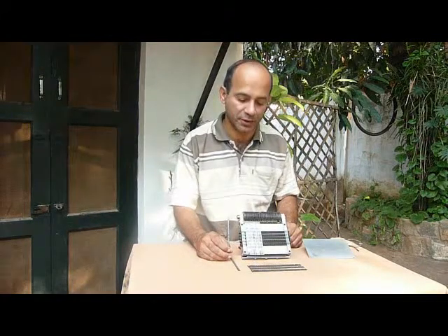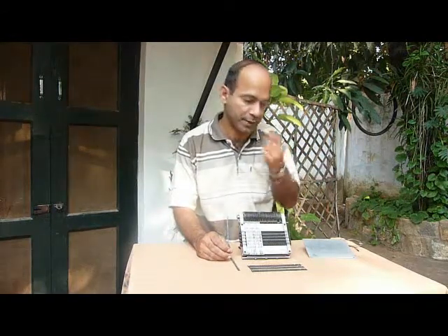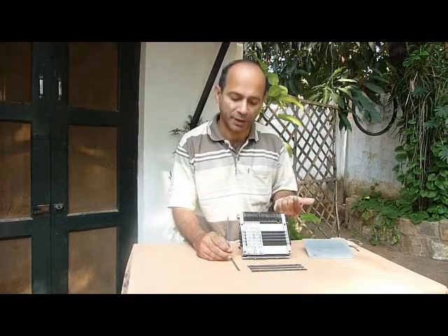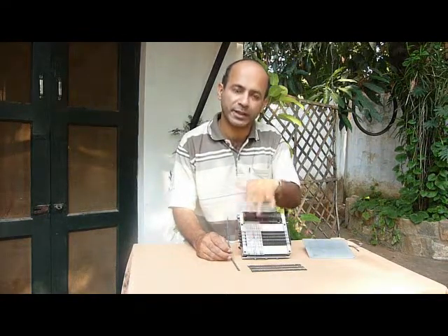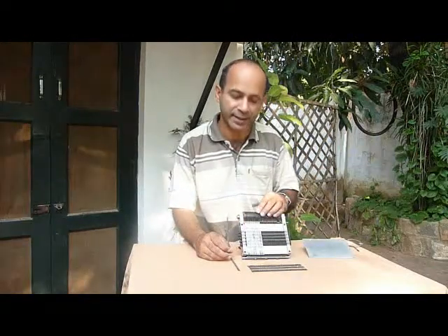I've used pins to produce the dots, and dot and no dot is the presence or absence of the surface of the pin. I mean the top end of the pin coming above the surface of the surface plate or below the surface. So it's basically pushing a pin up or letting it drop down. But it is essential that you control the pin, either to lock it in its recessed position or to lock it in its raised position after the information has been set.